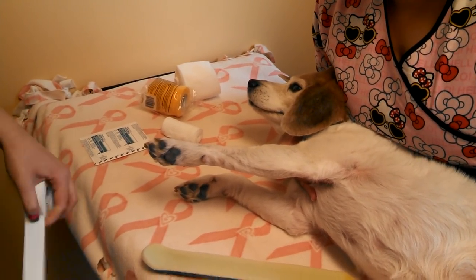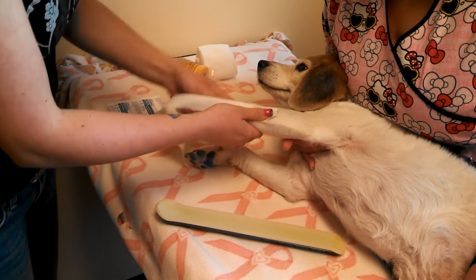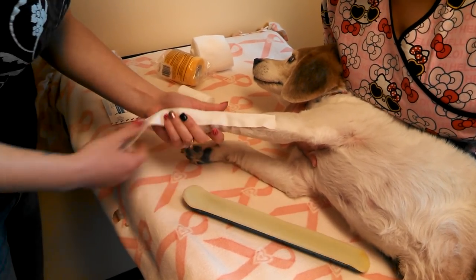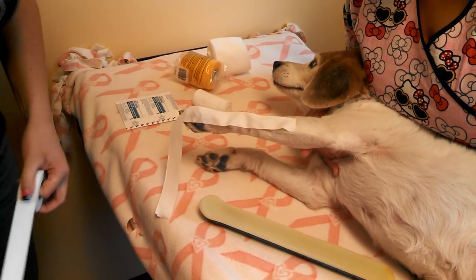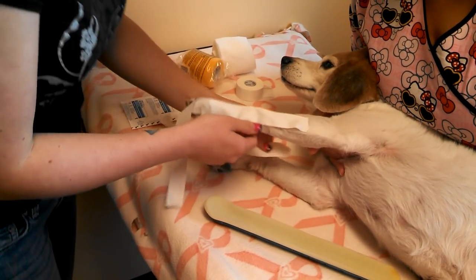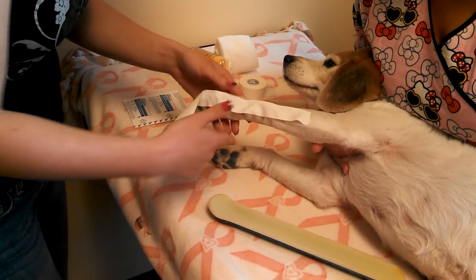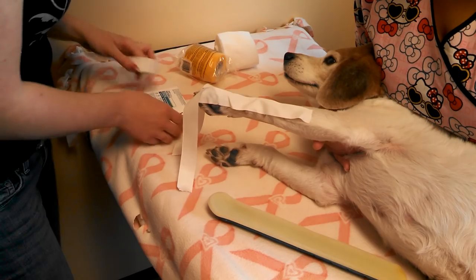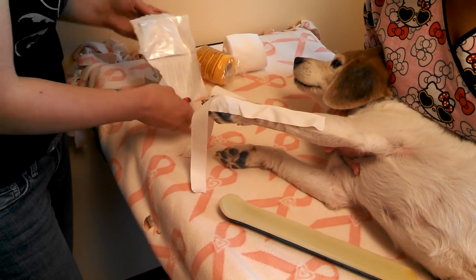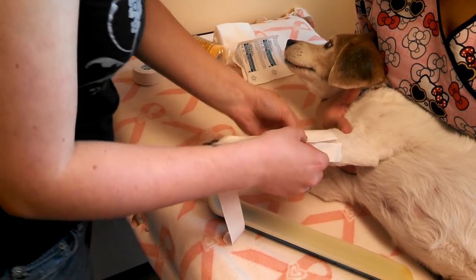First you want to do your stirrups and stay away from any of the wounds. We're pretending like there are wounds on top of her leg, so we'll cover those with that.